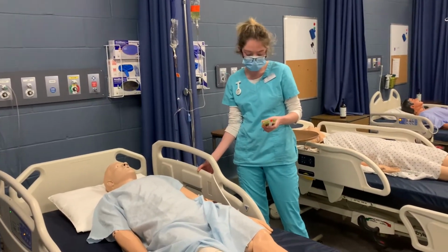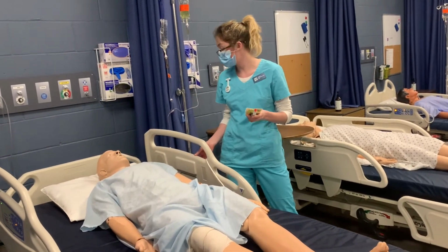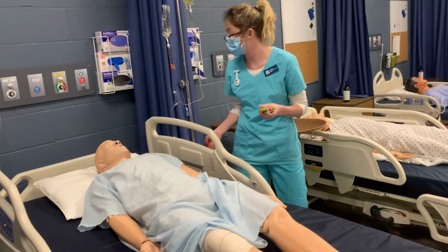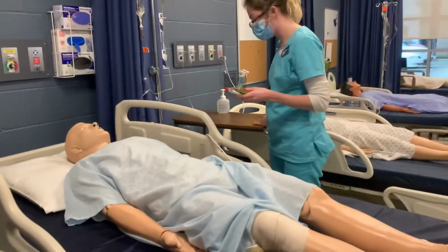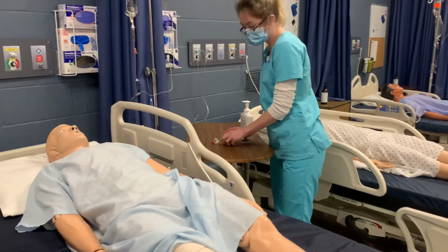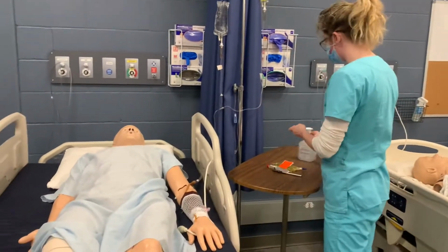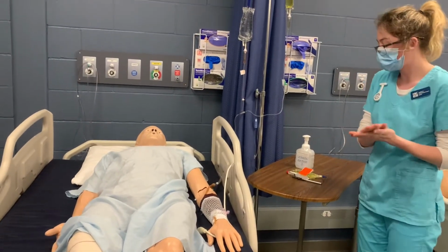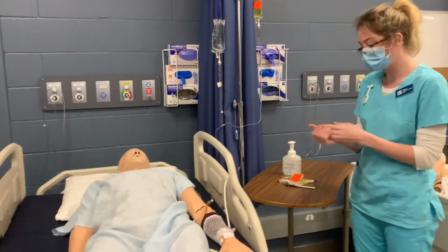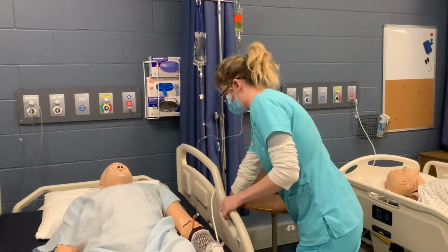All right. I am just here to change out your IV antibiotic. It's just protocol. It's normal for every patient who has surgery to receive an antibiotic to prevent an infection before it happens. It's perfectly safe, and it doesn't mean you have an infection. It's just preventing it before it gets bad.